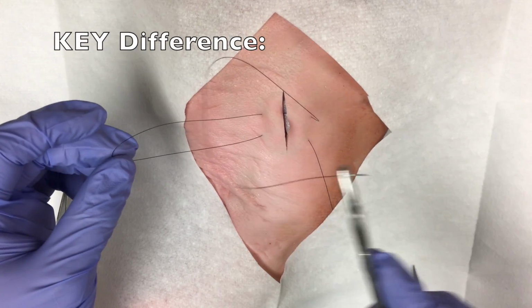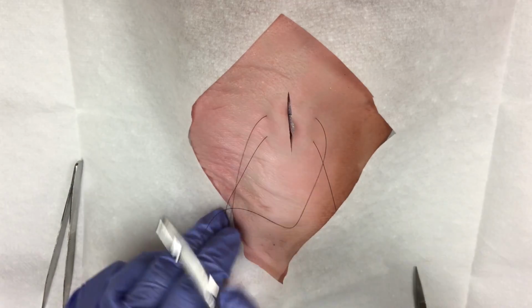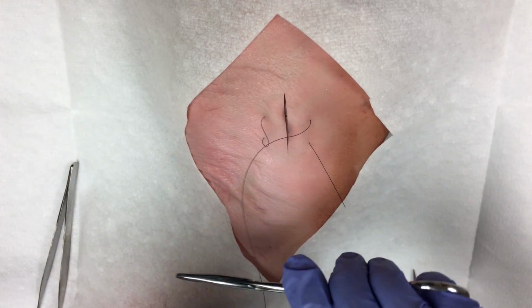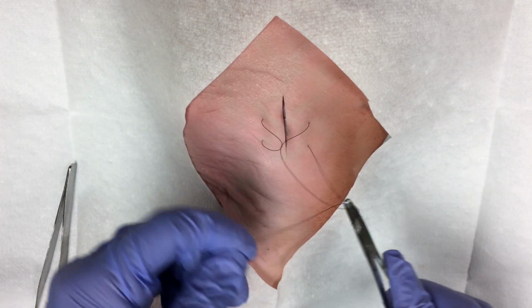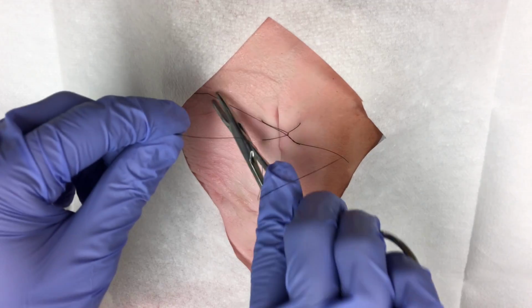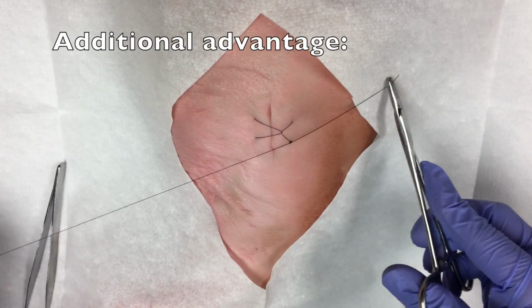Here's where the difference is. You'll leave a loop of suture on the far end of the wound, and you'll simply drop the needle through that loop. As you pull it through, it creates a locking effect, which drags the suture material on the far end of the wound across the wound edge. You'll then tie off your suture in the usual fashion using the instrument tie method.